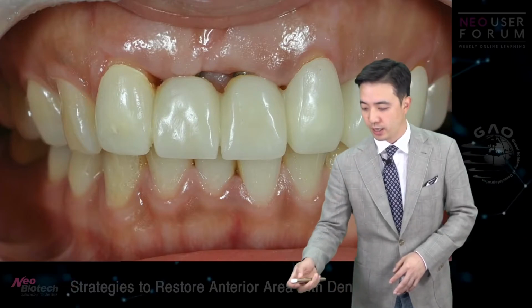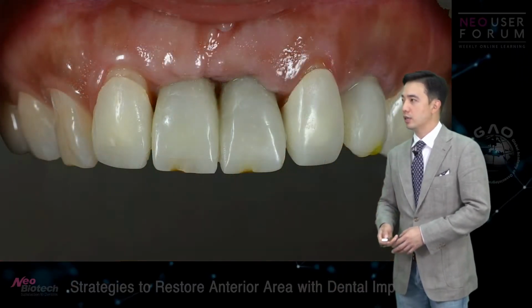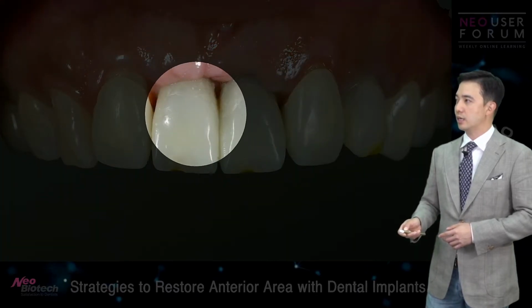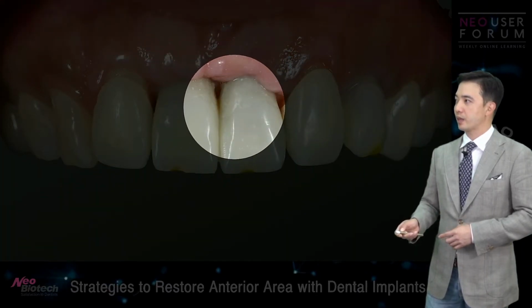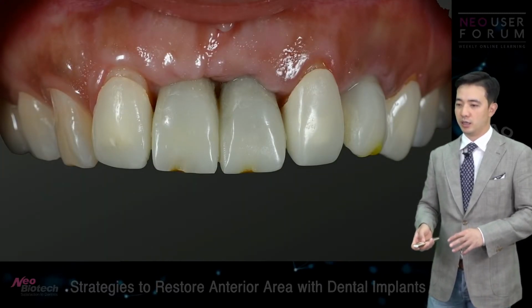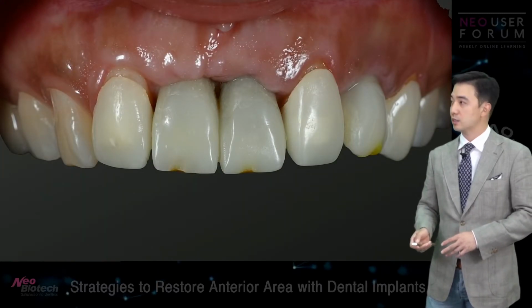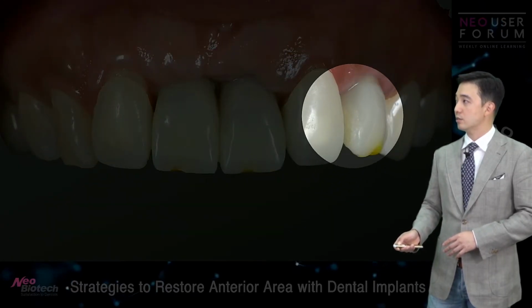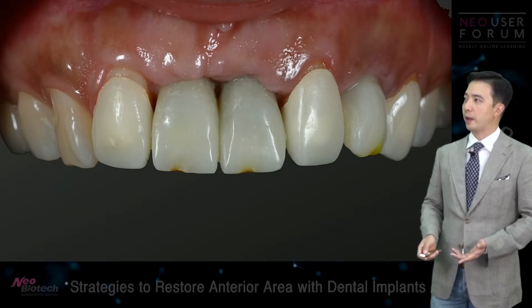And then after I thought those two were osseointegrated, I switched these two Pontic areas. So I connected directly to the implant, right? So these two are screw retained provisional restorations on implants. Also, you can hear the canine area, it's also a screw retained provisional restoration.